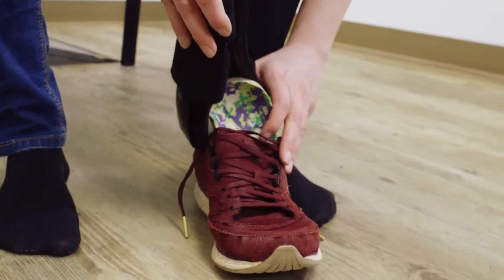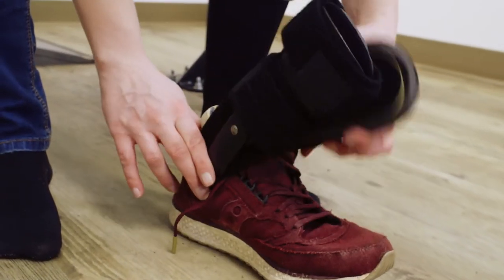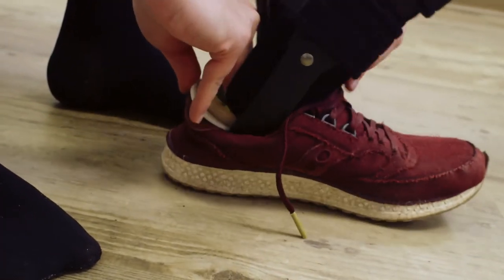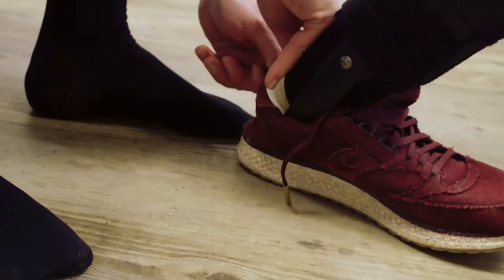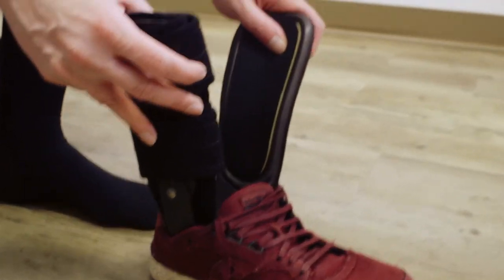I like to put it underneath the liner for a little bit more support, and I have my foot orthotic here so I'm just going to stick it underneath. It's a little bit easier when you have a shoe that has a stiffer back versus the one that I have right now. So you just kind of shove it in there. Now it's in and then you're going to put your foot in.